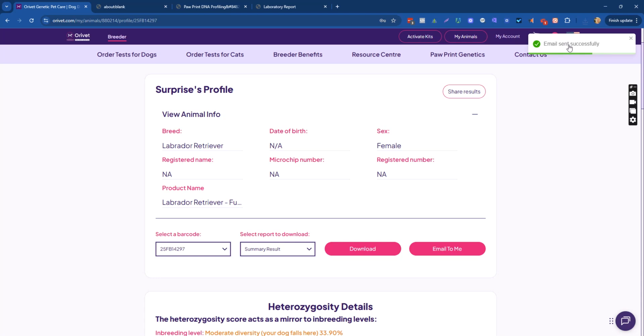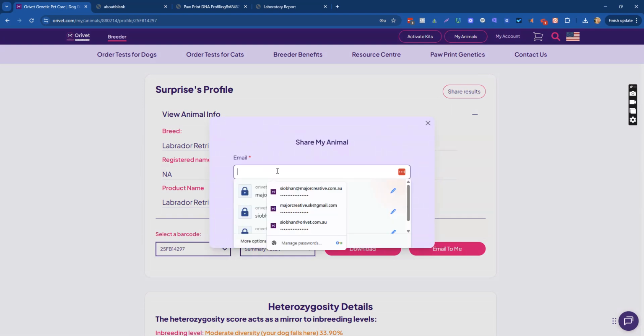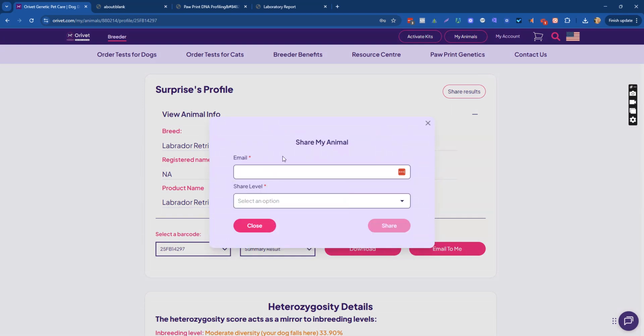And the first column here is breed sense, which really just refers to whether the test in question was breed specific. And in this case, because this was a full breed profile, all of the tests that were done in this particular test were all breed specific. So that's why it's got the green tick. If they weren't breed specific, they wouldn't have a green tick. And so then the test performed is listed here. What the result was is listed here.